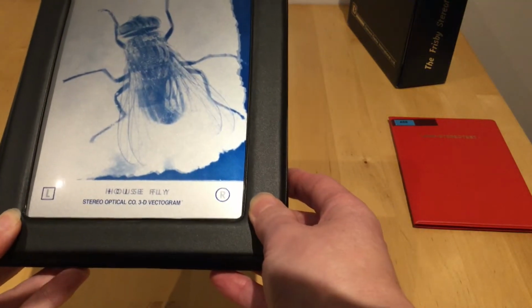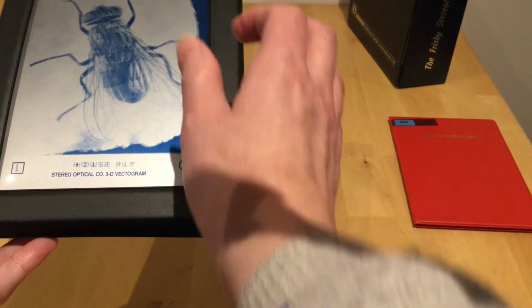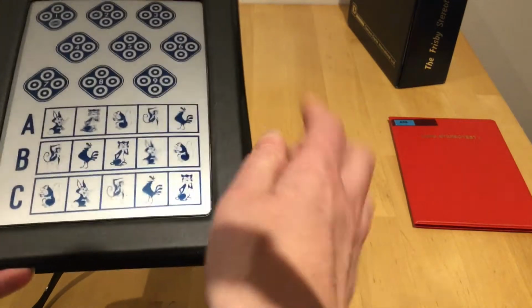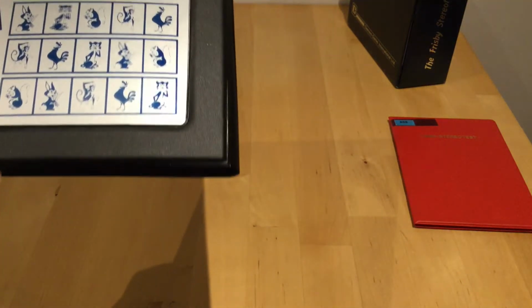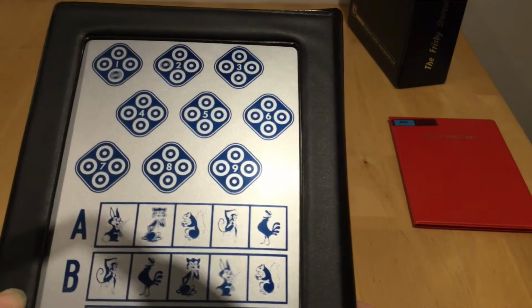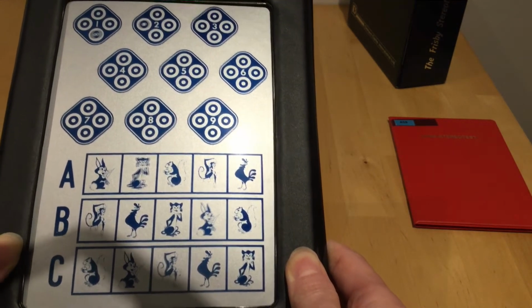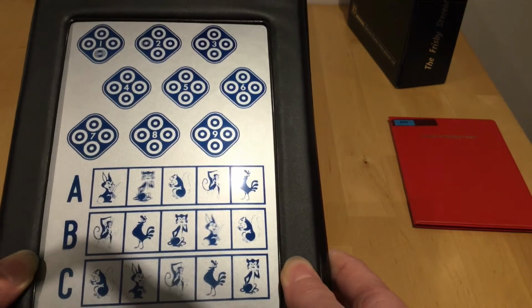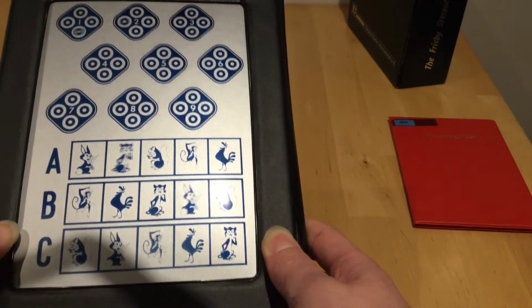Just now I realise that it's not going to be 3D for you watching, but at the moment I'm pinching the wings on the fly. So that's that page. On the other page we've got some circles, and when you again wear the glasses, the circles on the top line, there's one of the 4 in each diagram that is standing out. So in number 1, it's the bottom circle. You can just ask the child which circle's jumping out at you. In number 2, it's the circle on the left, and number 3, it's at the bottom.